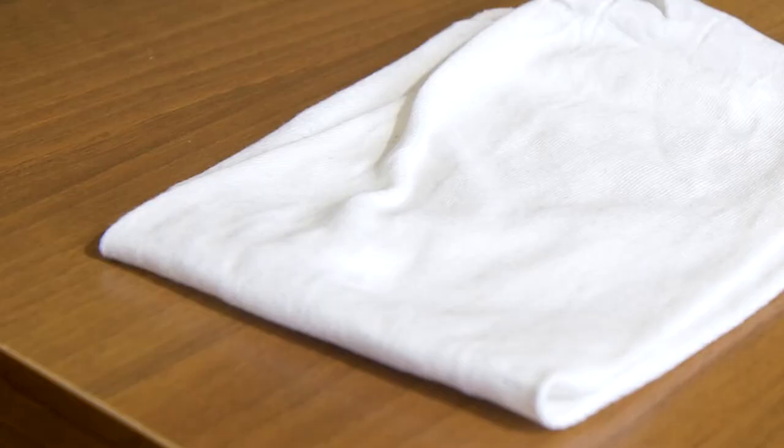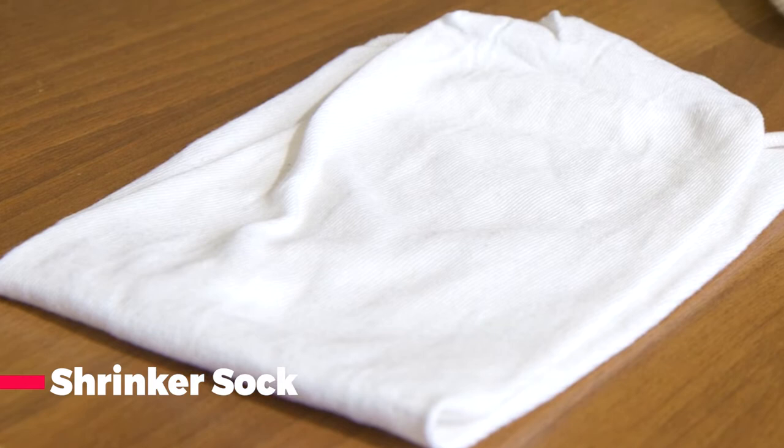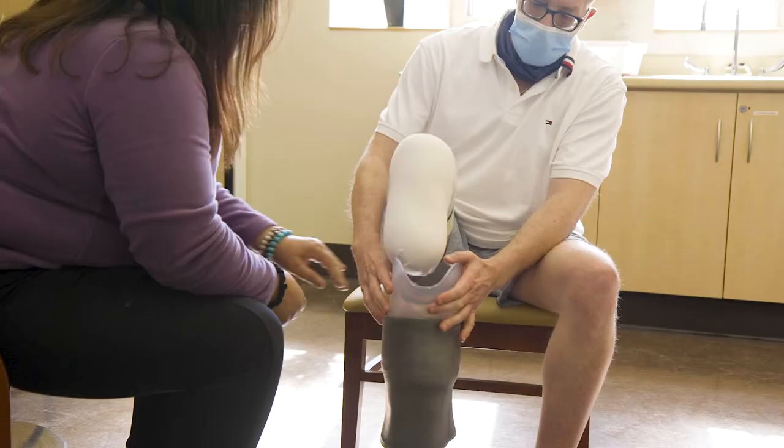Wear a shrinker sock when you are not wearing your prosthesis. This sock is designed to keep your residual limb tight, smooth, rounded, and stable.